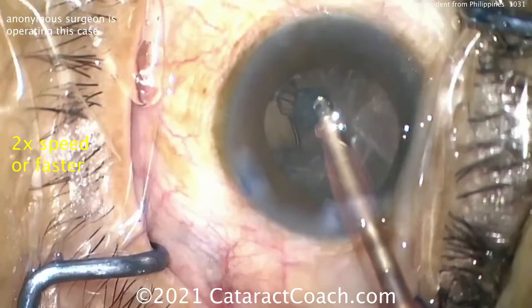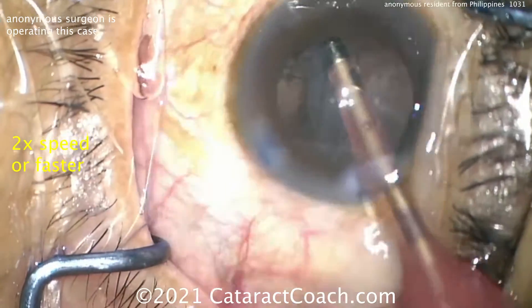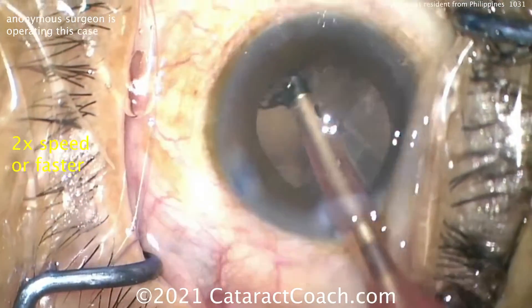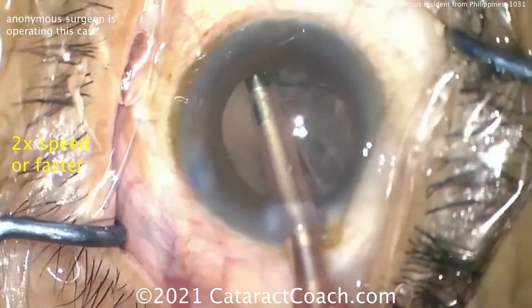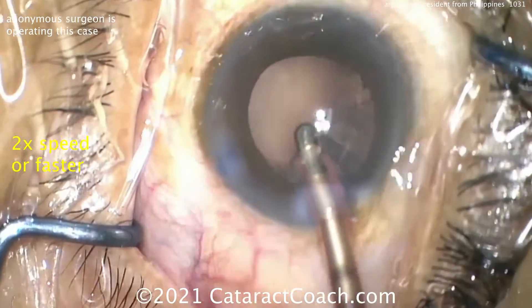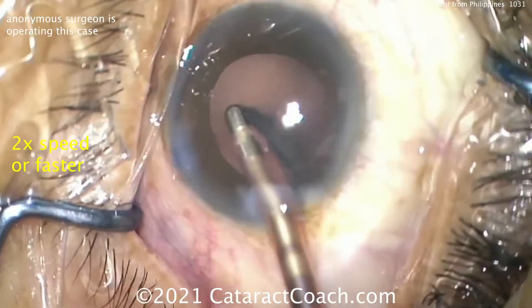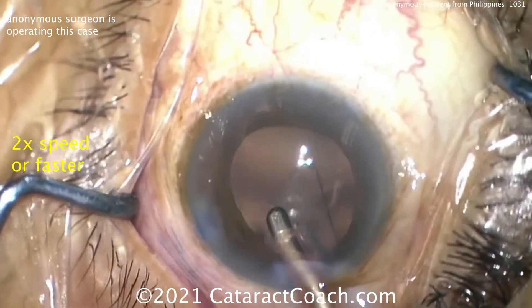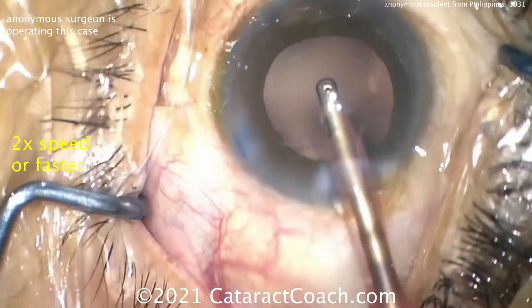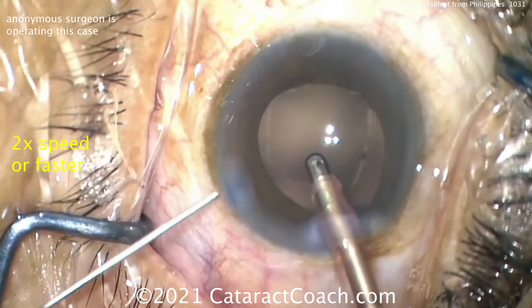Let's take down the cortex. Instead of stripping in smaller pieces back and forth, go circumferential for at least a couple of clock hours and then bring it centrally — that way there'll be a lot less repetitive stripping. Taking out the last bits here — pretty good, looks great.